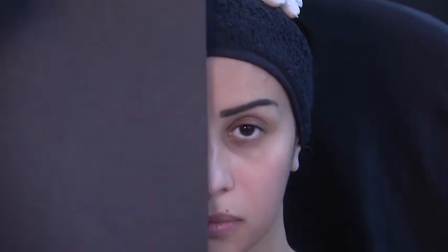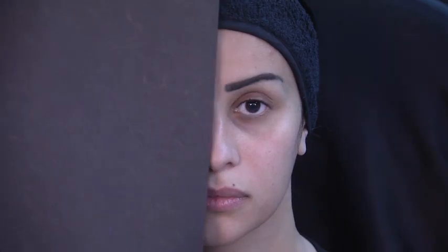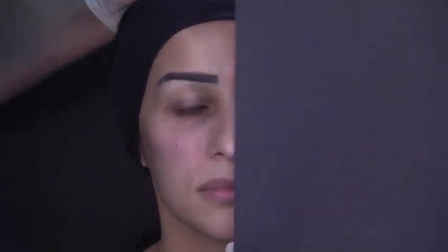I'm going to show you now the result. Can you look at the camera? Can you zoom in a little bit? Right. So this is the result. You can see, go down a little bit like this. That's the non-treated area, a little bit of a flattened cheekbone. Look at the tear trough. Although she's young, it looks great, okay?